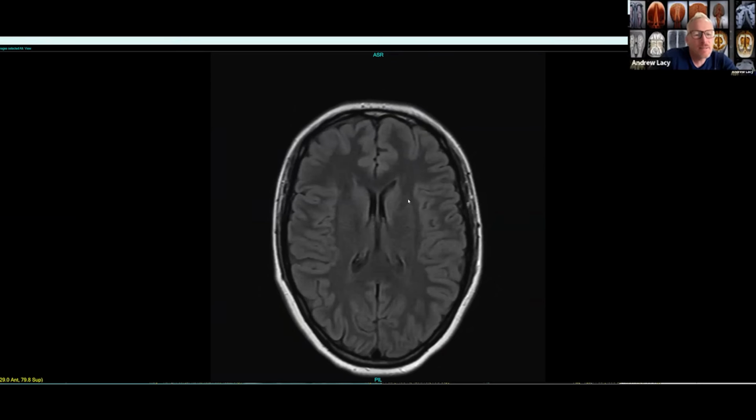Talk a little about, I'm going to sort of reinterpret a question that an anonymous attendee asked. It's about doing a wet read, where we review the images while the patient's still at the facility to determine if we want to redo any images. So, can you talk a little bit about the training and quality of our MRI techs, and how we have a QA process for those images, as the patient is there in the facility?